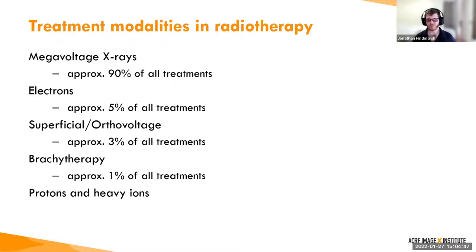So what are our modalities? The majority of our patients are treated with megavoltage X-rays, but we also treat with high energy electrons, superficial orthovoltage, which is kV energy X-rays, and brachytherapy, which is physical seeds of radioactive material that are inserted into patients. Then a small proportion are treated with protons and heavy ions, which we won't be covering.